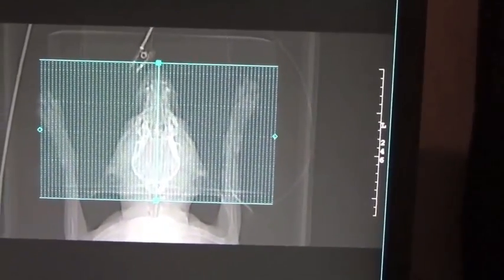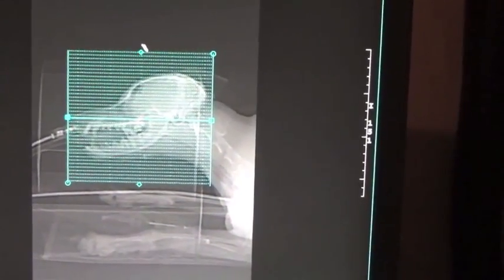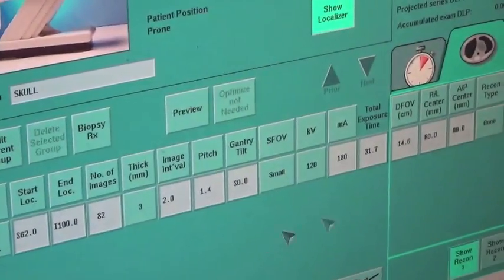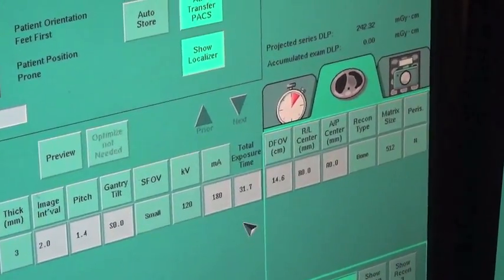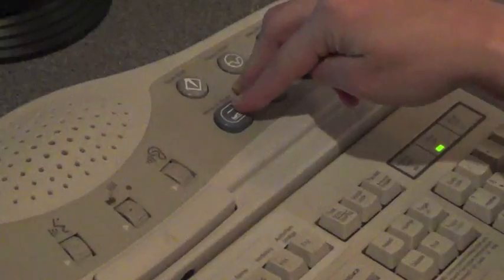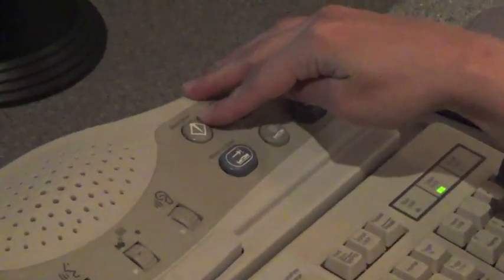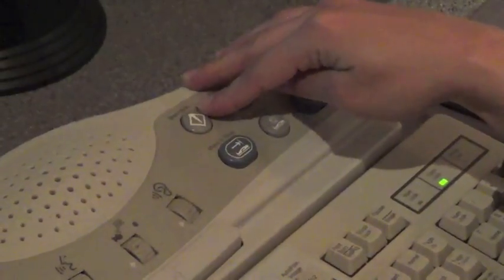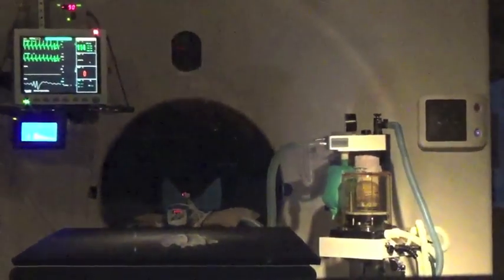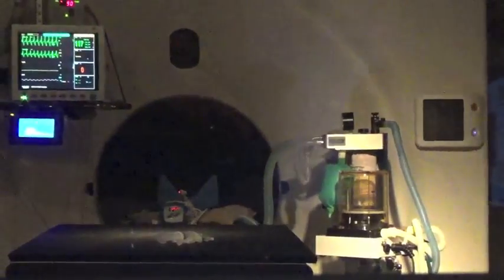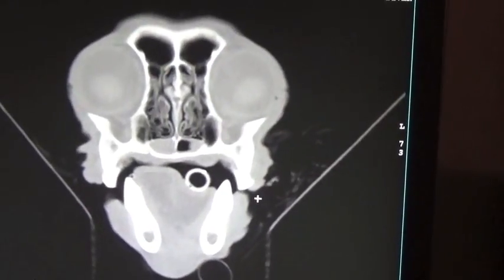With the sample volume set, there are a few more study parameters to set and double check. During this time the study is optimized to allow the best compromise between image quality and the physical limits of the CT system. With the aid of computer processing, optimization can be performed very rapidly. The scan settings are confirmed and the patient is moved into position to begin the planned series. Images are displayed in order of acquisition at the control console where positioning and other settings are re-evaluated in real time, ensuring additional quality control of the scan.